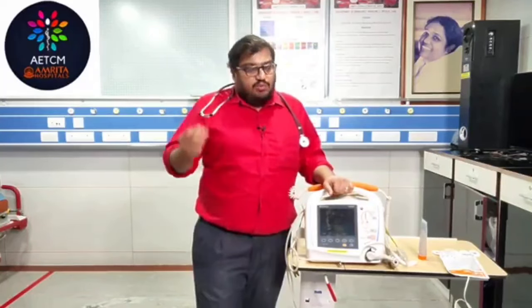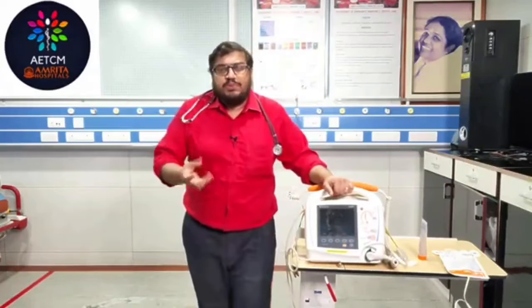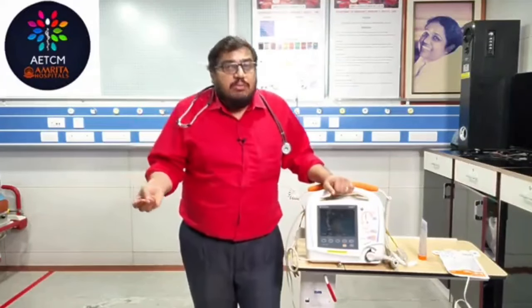So when you have a tachycardia, that is heart rate more than 100, and usually in case of an unstable tachycardia, it will be above 150, whether it is SVT, AF or multifocal atrial tachycardia. In that scenario, if the patient is unstable, I said what are the signs of instability, you have to cardiovert the patient. Cardioversion is not just a simple procedure. You have to have a little bit of knowledge regarding cardioversion, and in different scenarios you need to select different amounts of energy.